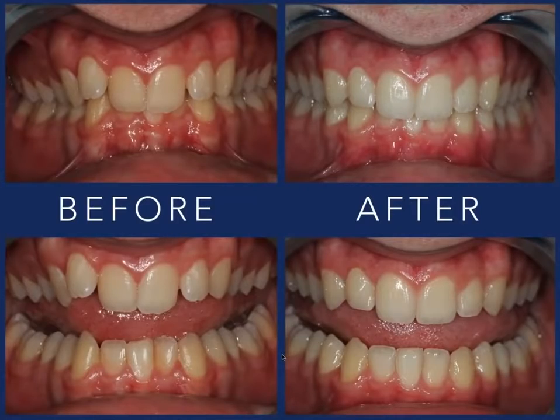And as you can tell, we were able to do some pretty impressive work for him, where we expanded the arch, got a drastic improvement on the deep bite, and kind of dialed things in there. And this was done, pretty excitingly, in 3.5 months. He changed his trays out every 3 days, and we were able to get this achieved in 3.5 months. So pretty cool. He used Propel and VPro 5.